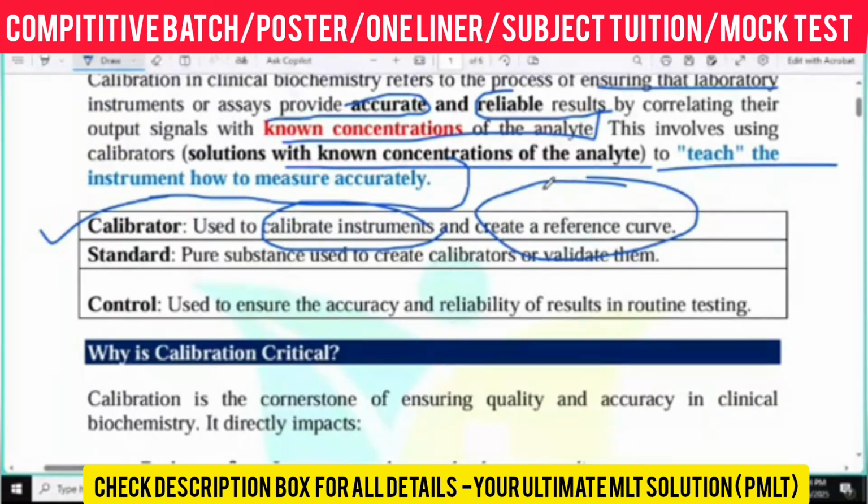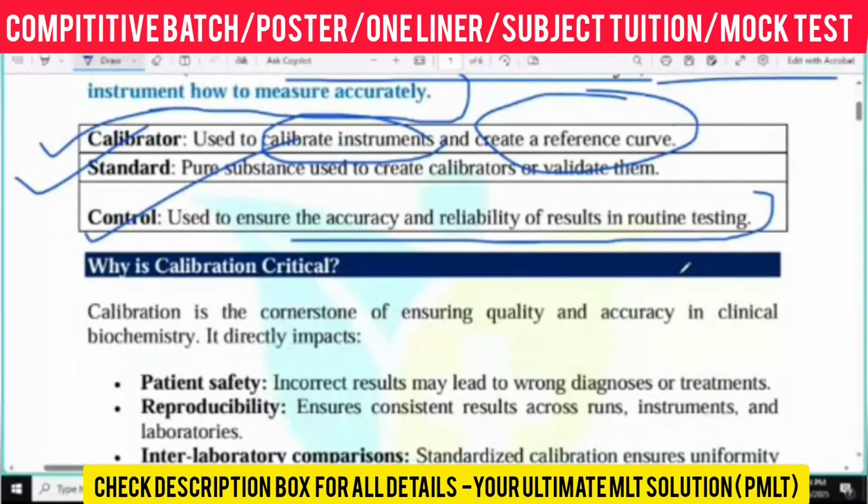After that, the control. To ensure the accuracy and reliability of results in routine testing, we have to use a control, a normal sample, to verify the accuracy and reliability of the result in the routine laboratory.